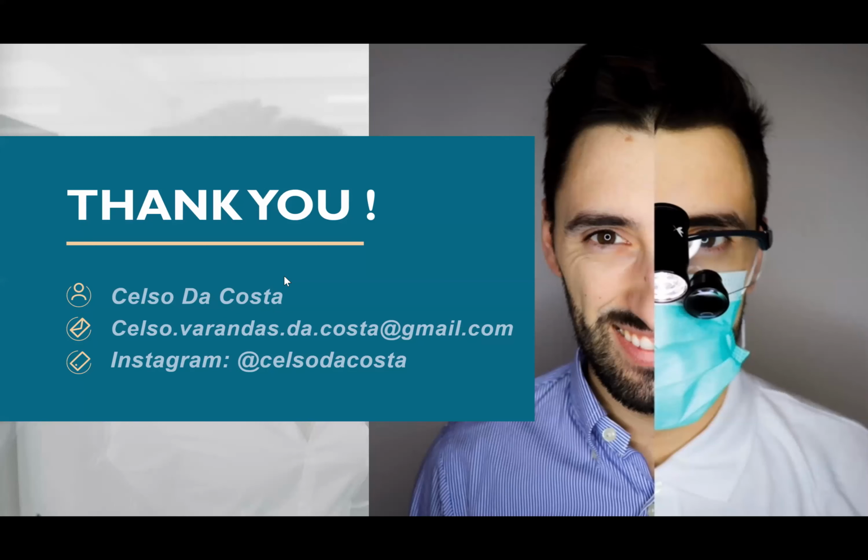Should the gum be totally healthy for using Click? Yeah, or at least no bleeding. At least no bleeding, but the best thing is having good periodontal health. Yes. Okay, and another question: no need for isolation for gum protection? No need for any kind of gum protection. The only thing I am using is the Optragate or a mouth opener to keep the patient's mouth open during the 10 minutes.